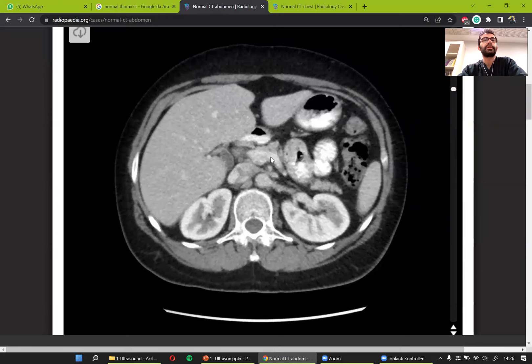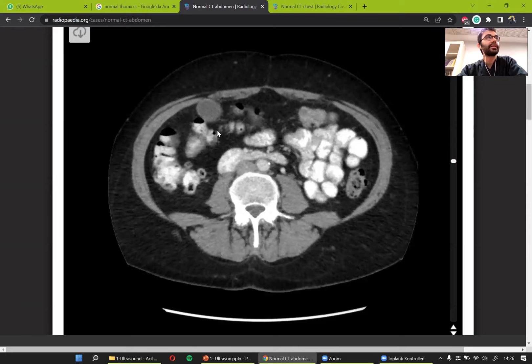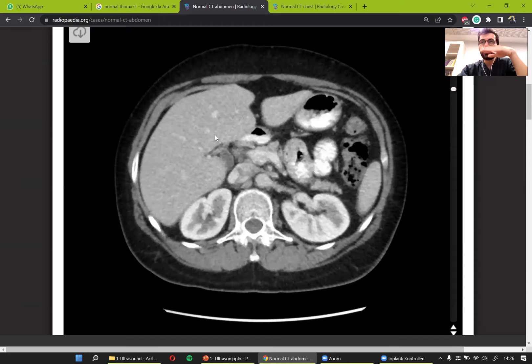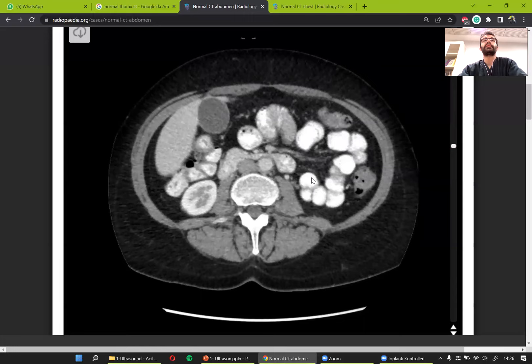Going back up to the pancreas level. One important structure is the gallbladder, which is important because of its many diseases like gallstone disease. We see the gallbladder right below the liver. On either side of the vertebra, we see the kidneys.